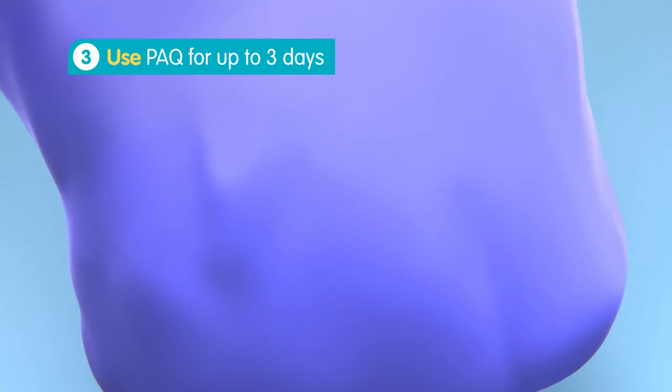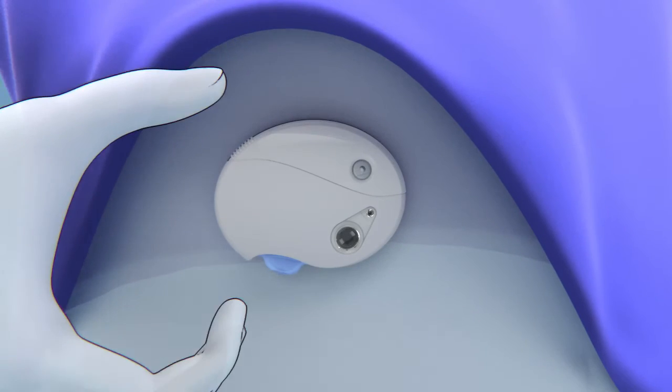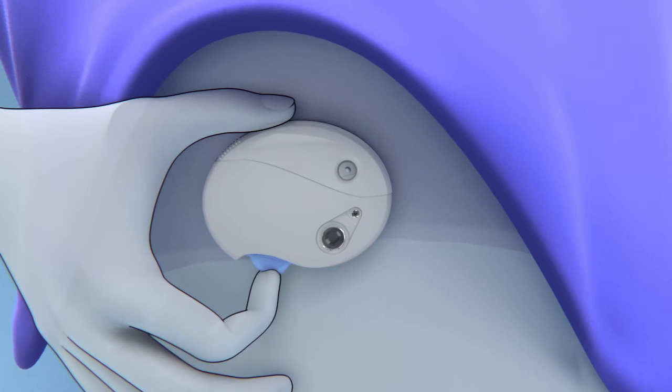Now you can go and live your life for the next three days. Enjoy activities, shower and swim. At mealtimes, a bolus dose is easily administered by pushing the bolus button. Every button click provides two units of insulin.